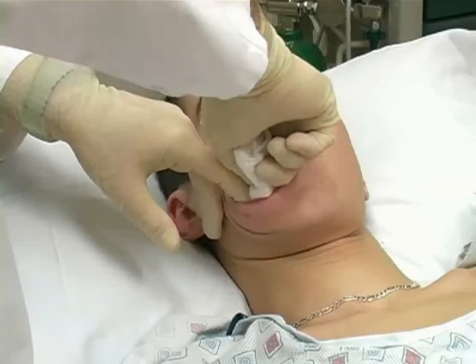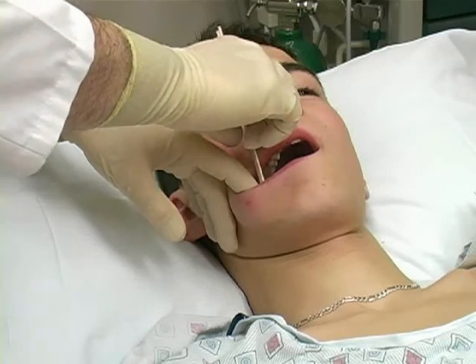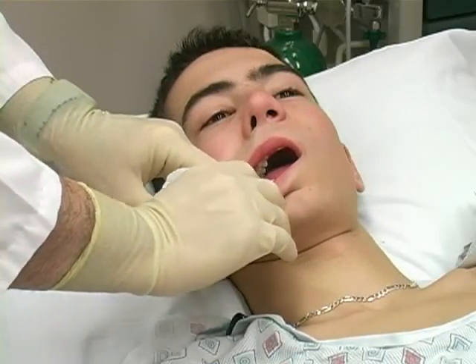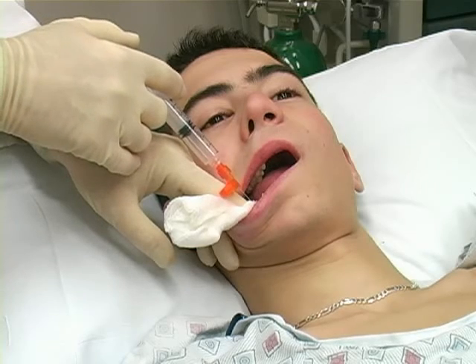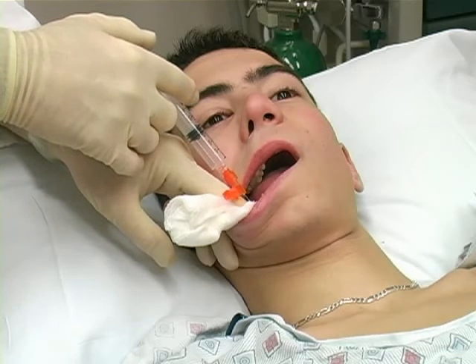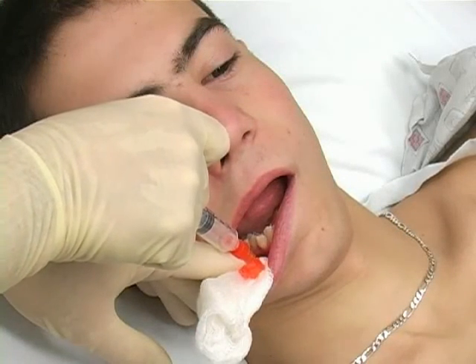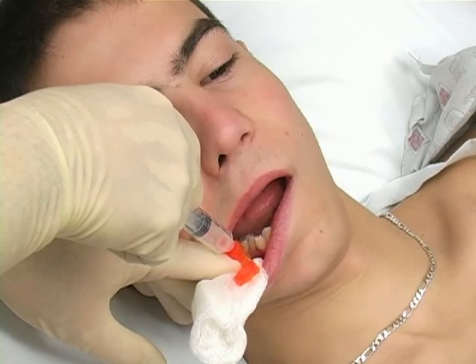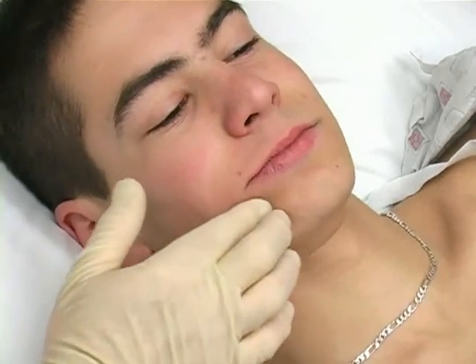First, dry the area with gauze to prevent saliva from washing away the anesthetic. Then, apply a topical anesthetic such as benzocaine to the region. Use a piece of gauze to retract the lip and expose the mucobuccal fold. Insert a 3.5 centimeter, 25 gauge needle into the mucosa and direct it at a 45-degree angle to the mental foramen. Aspirate to exclude intravascular placement and inject 2 milliliters of anesthesia adjacent to the foramen. Massage the area for 10 to 15 seconds after injection to hasten the onset of anesthesia.